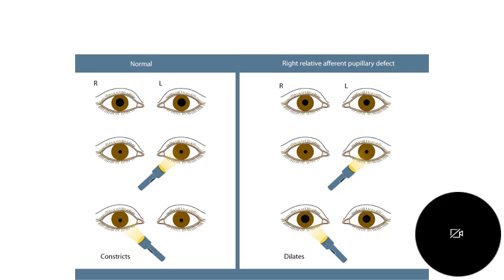So on the top, we have a person looking straight ahead. I would estimate that in a normal person, this level of pupillary dilation means their pupils are about 5 millimeters. Now, light was shined on the left eye here. Do you see that the pupil is constricted? And while the light is being shined on the left eye, what is happening to the fellow eye? It is also constricting. Remember, the pupil constricts to light and both eyes work together. Now, the examiner swings the light over to the right eye. What happened? The pupil stays constricted and the pupil in the other eye matches it.